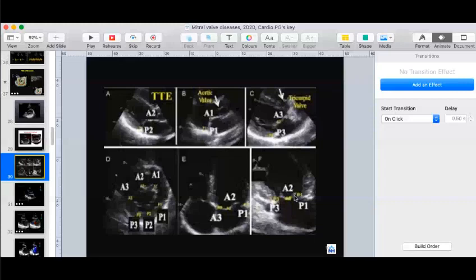So this is one bit of leaflet segment you see, and then you see a small segment bobbing or coming back and forth. So this is going to be A2 here, and towards the inferior wall is going to be the P3. So always remember commissural view segments: P1, A2, P3. So this you have to remember. I'm trying to keep it simple. It is very confusing. So parasternal long axis, A2, P2; apical four chamber, generally A2, P2; and the commissural view in the two-chamber view, P1, A2, P3. Is that okay? It is just one slide, information about how to look at segments. Okay. Yes, sir.